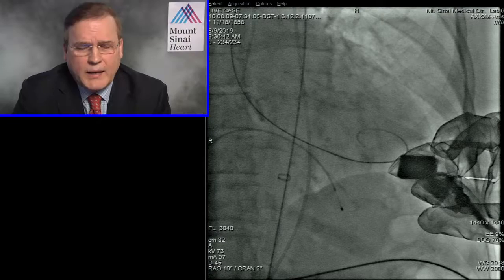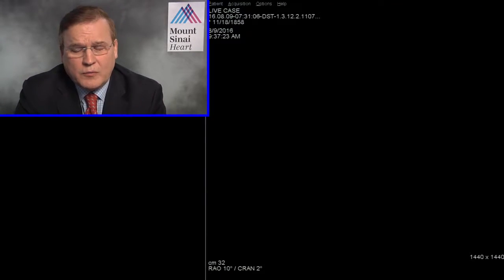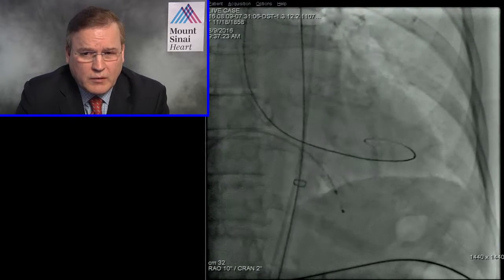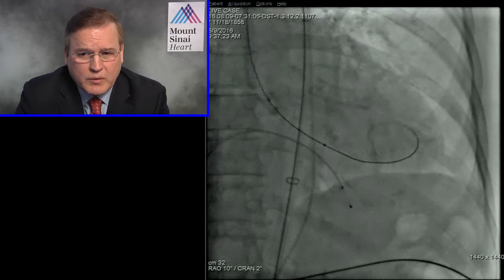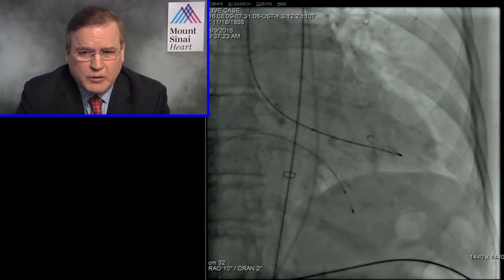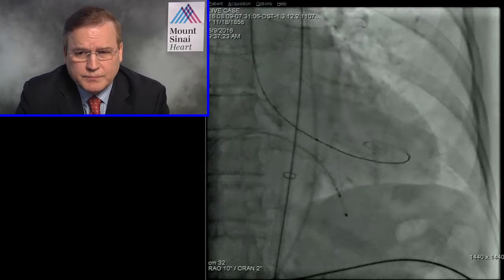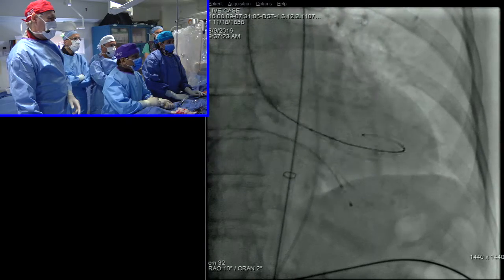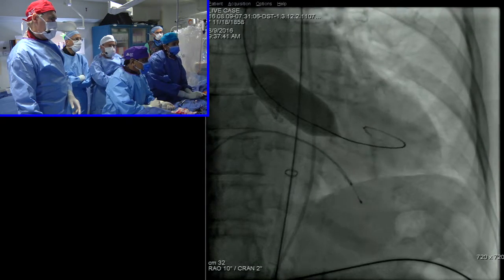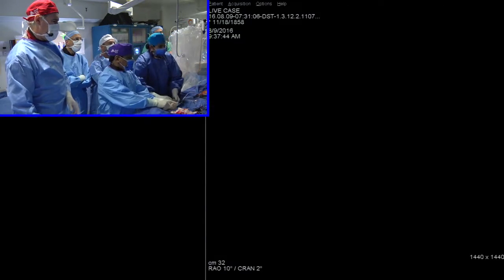Yeah, and as you highlighted, the procedure is being associated as an independent predictor in 72,000 patients, just recently published in JACC this week. Okay, pacing 150 is the post-procedure BAV. Yes. You're absolutely correct. So key is that anything which will avoid the post-procedure risk. Good. Go. Good. Stop pacing.